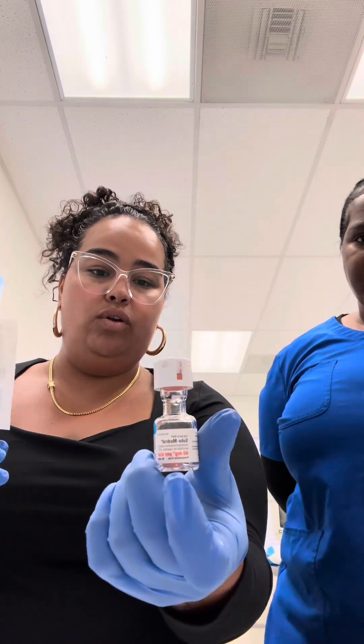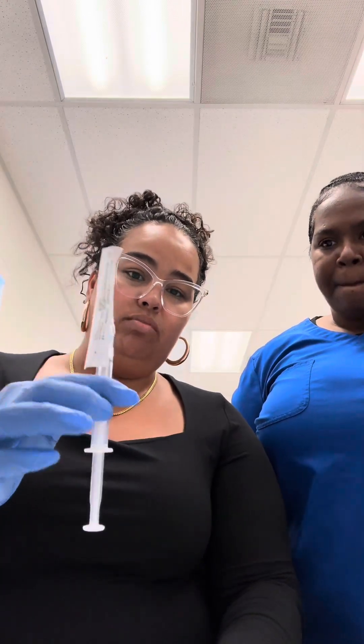And that's Solu-Medrol 40 milligrams. This will be given intramuscularly for the patient.